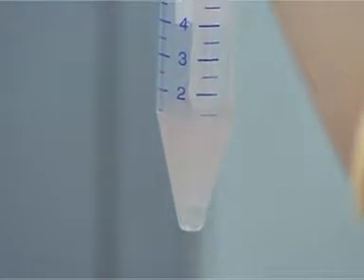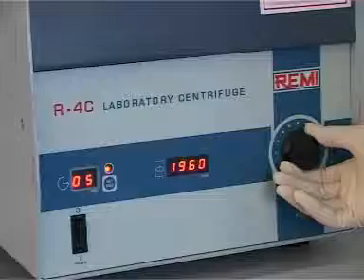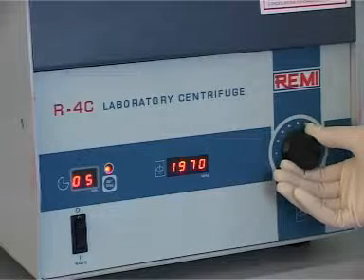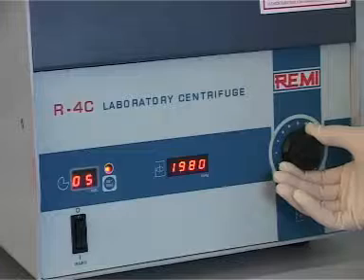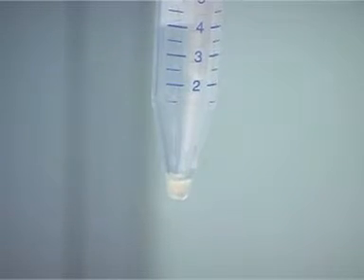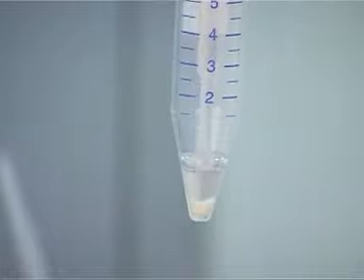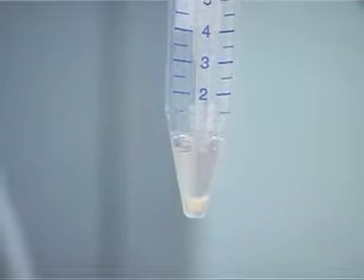Mix well. Centrifuge at 2000 rpm for 5 minutes. Discard the supernatant and keep the pellet. Add 0.5 ml of semen washing media to the pellet.